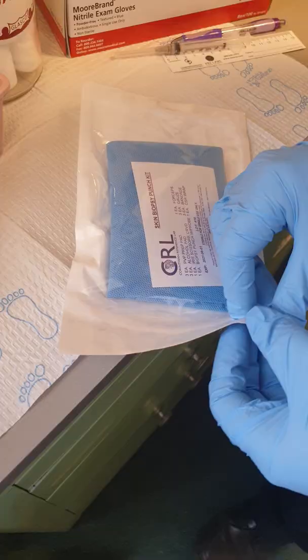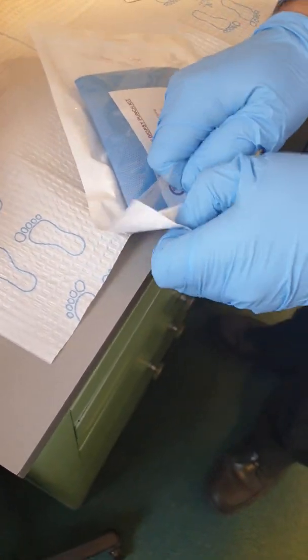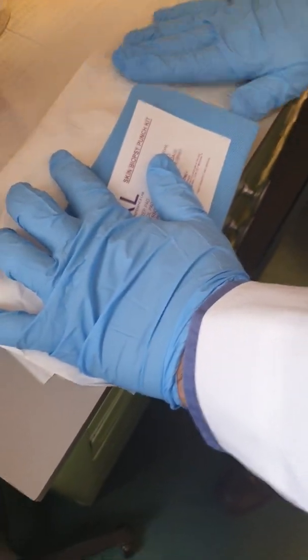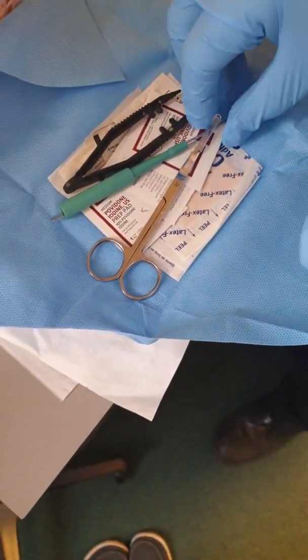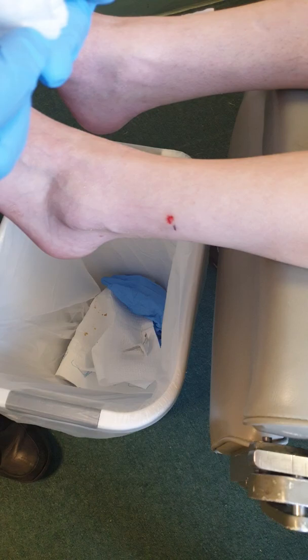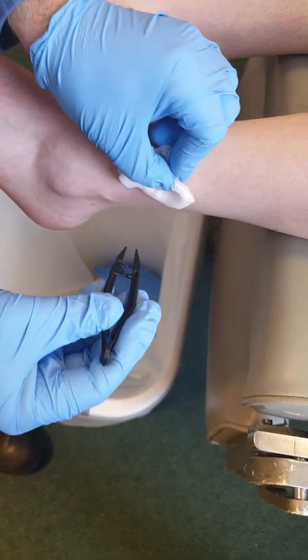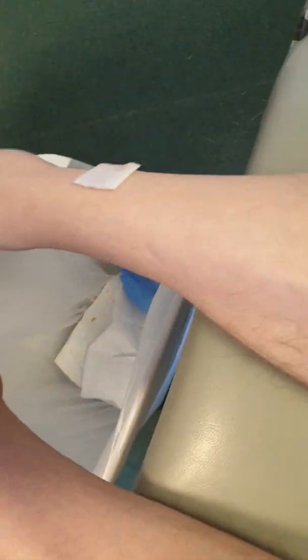What we do is open up our kit — as you can see, it comes with everything that we need. We take a look at the tweezer and just test anesthesia. It comes with a few of these. Do you feel that? No, okay good. How about this one? No, okay, so we're ready there too.